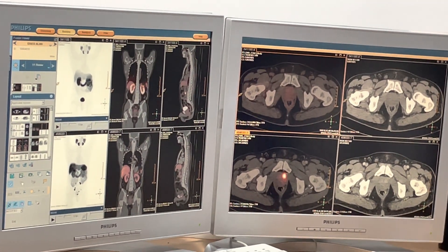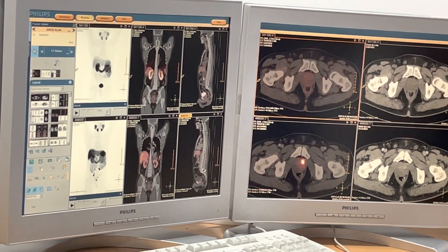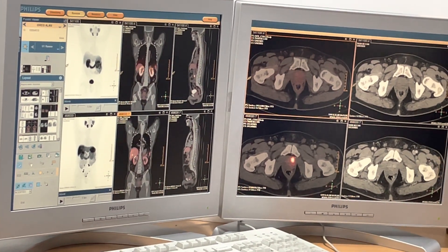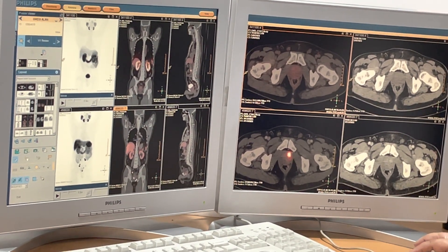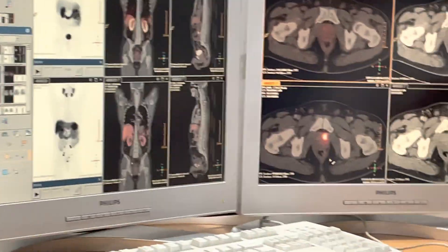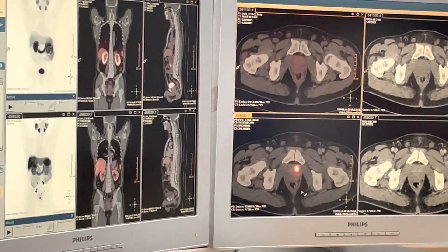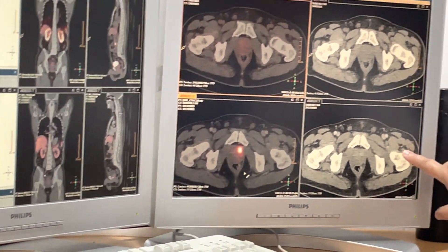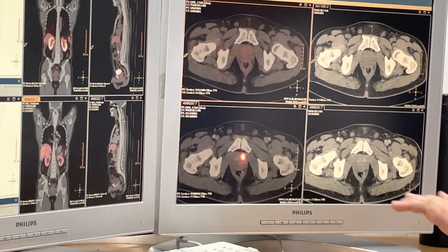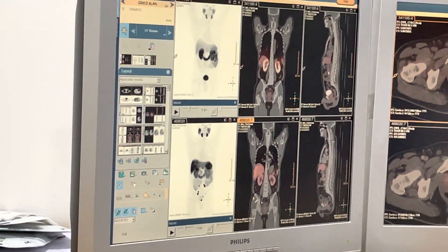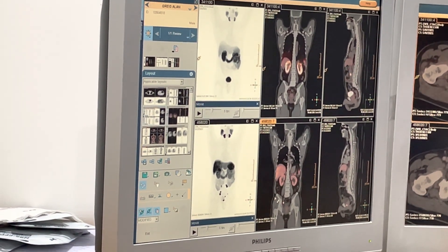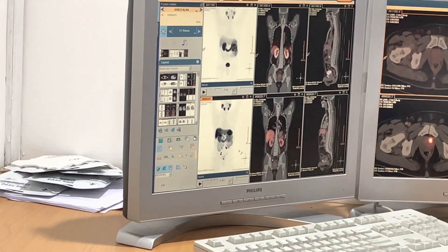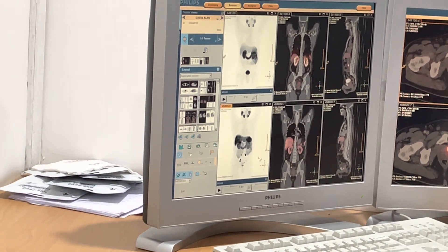This is called the sagittal, which means we are slicing him sideways, and this is the coronal, which means we are slicing him from behind forwards. So you can see the same things on different projections. All reporting is done on an axial image because this is where we can see slice by slice each of the lesions. This is called a MIP image — maximum intensity projection — where we stack all the axials and create a three-dimensional image.